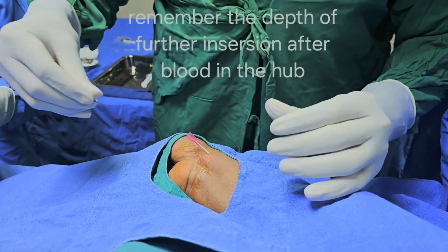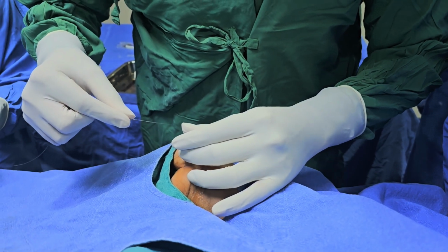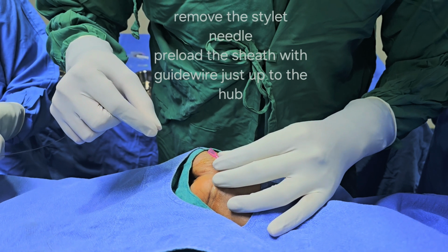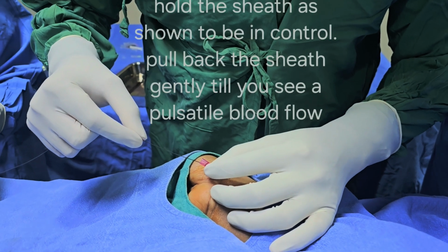At this point, what I do is I preload the hub of the sheath with the guide wire. This makes it easy to insert the guide wire in once I see a pulsatile blood flow. Hold the sheath as shown. To have control over the pullback, slowly pull back 1 mm at a time.